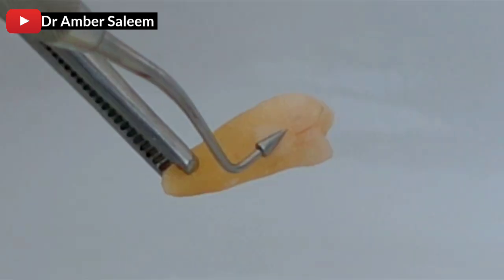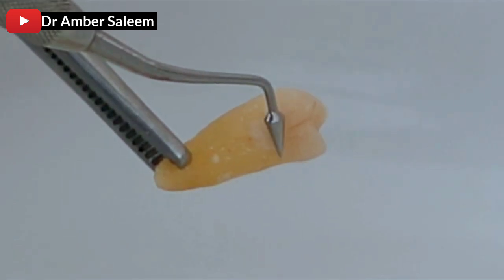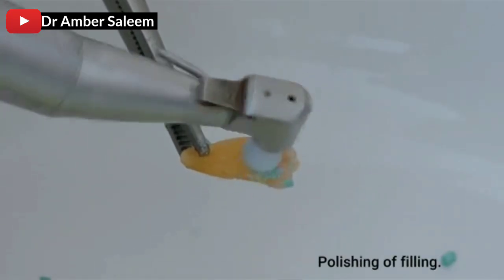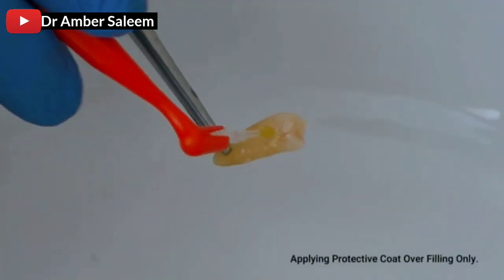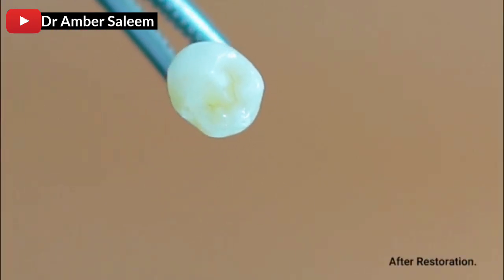Polishing of filling, applying protective coat over filling, only curing up protective coat over filling — only after restoration.